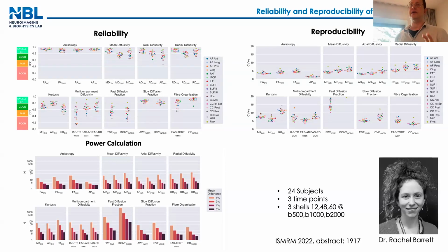Realize that the sensitivity is different for each matrix. When you go higher, probably the only thing I want to look at is this graph here. This one, actually, this one is the best. The more complex your model is, the more sensitive it is to noise. It's obvious. If you have 30 measurements and you fit one parameter, you get one stability. If you have 30 measurements and you fit 15 parameters, clearly you will be more sensitive to noise instability, okay?